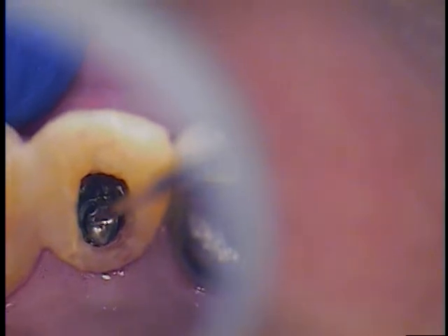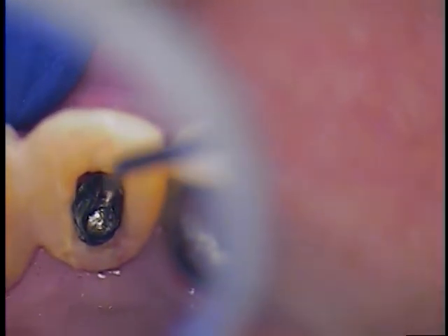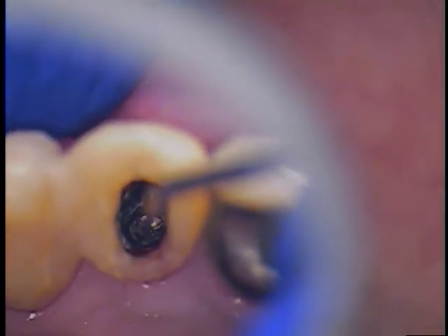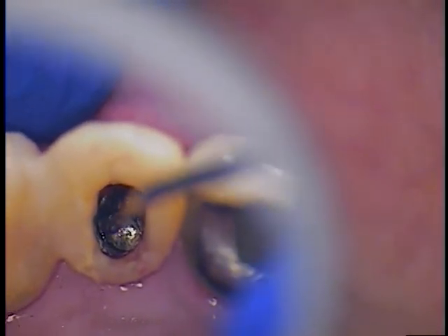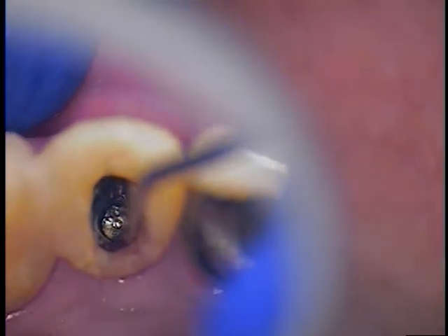Hey, Dr. Cuomo, back here with this Straumann case. We got the screw nice and loose now. We took the head of it off, so here we go. We're spinning it out slowly but surely, going in a counterclockwise rotation, staying away from any threads. I'm well within the parameters of the abutment, and it's a good day.